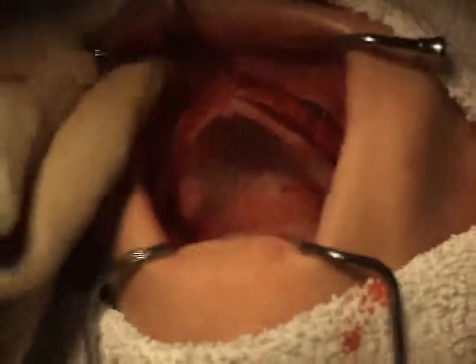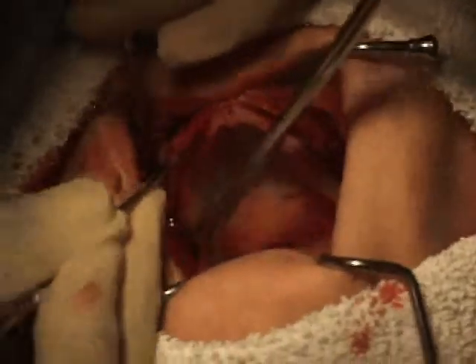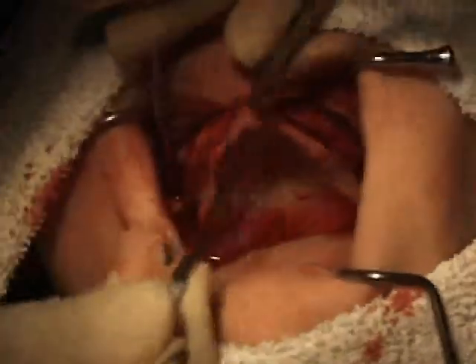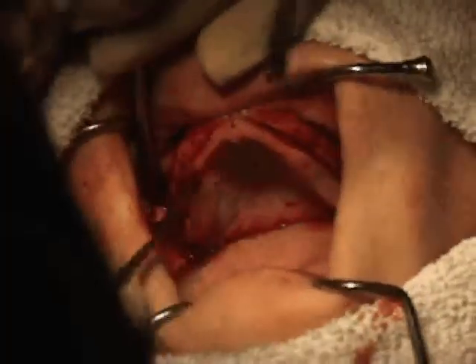The theory is that we're going to sandwich the implant between two osteogenic structures, namely the alveolar ridge and the periosteum. We feel the osseous integration is greatly enhanced by placing the sub between these two structures. This enhances bone growth and totally engulfs this implant in solid bone.